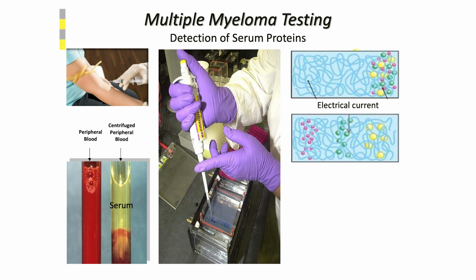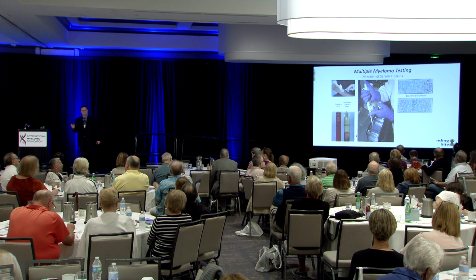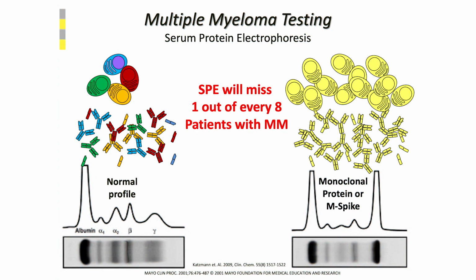And it's a straw-colored liquid. And in that liquid are the components or the things that plasma cells produce. So remember all those immunoglobulin molecules that I told you about that are real small and soluble? They're in there. They're in the serum. So if I take that serum and I mix it with a blue dye and I load it in a gel, and if I was to describe what this gel looks like, think of Jell-O, clear Jell-O. That's a real thin slice of clear Jell-O. So not a big block, a real thin slice of clear Jell-O. And I can load that serum sample with the blue dye onto that gel, and then I can apply an electric current across that gel, and that electric current will cause those proteins, because every protein in your body has a charge, either positive or negative. And remember, opposite charges attract, right? So this current will cause these proteins to migrate through the gel.